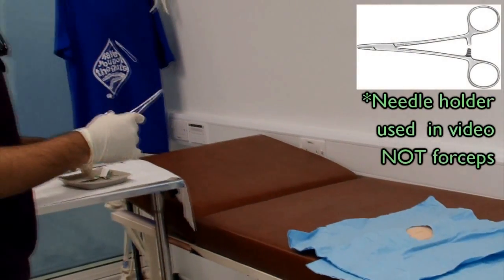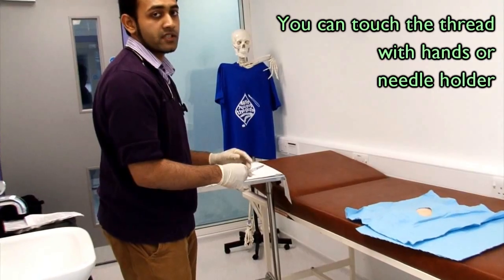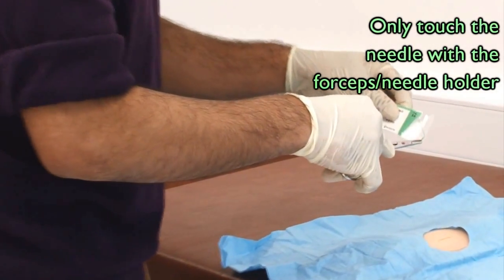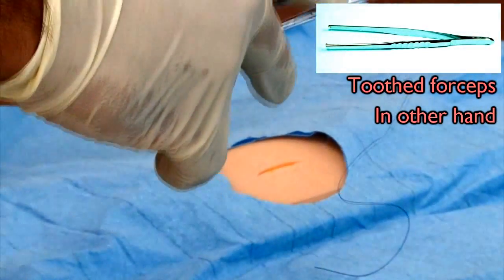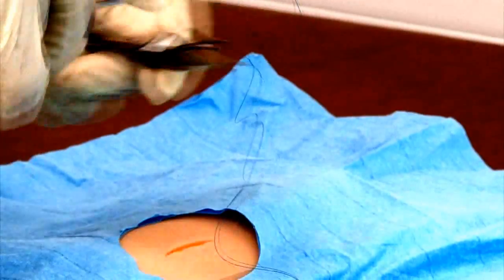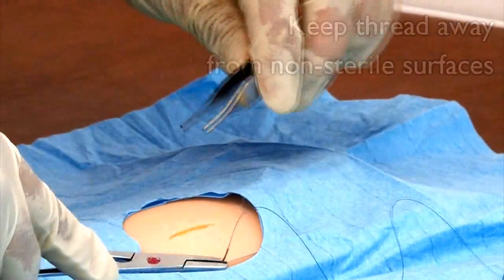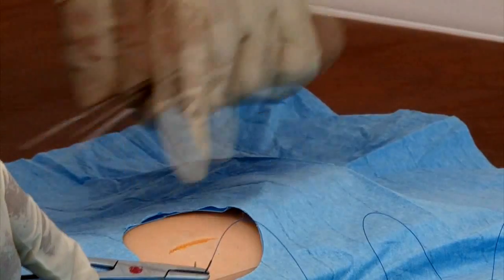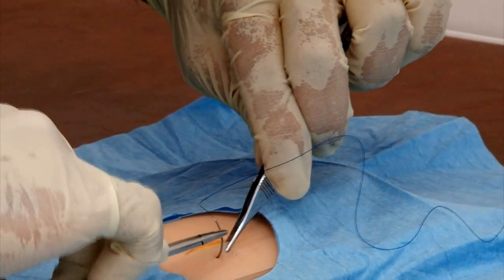Using the forceps, draw the needle out of the pack. Make sure that you don't touch the needle at any point during the procedure. Position the needle in the way that's most comfortable for you, and make sure that the thread doesn't move away from the sterile area. You should always do the first suture in the middle of the wound. Pinch this side of the wound and pass the needle through like that.